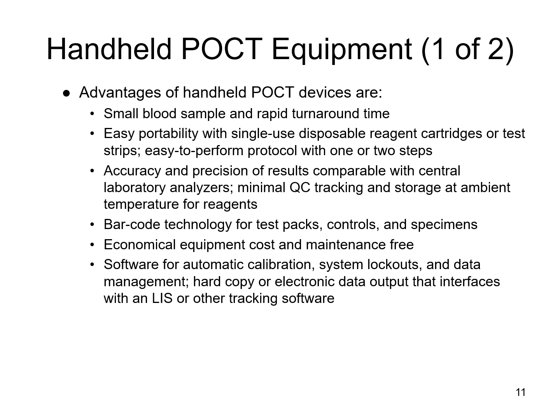Depending on the test method, it can be costly, but it can also save money as well. Generally, these are used more for screening processes. If anything is considered critical, let's just say you had an iStat performed and it showed that the patient had a hemoglobin of 6, that might be something that you would verify by actually sticking the patient, getting a venous puncture, and sending that to the laboratory to be verified.